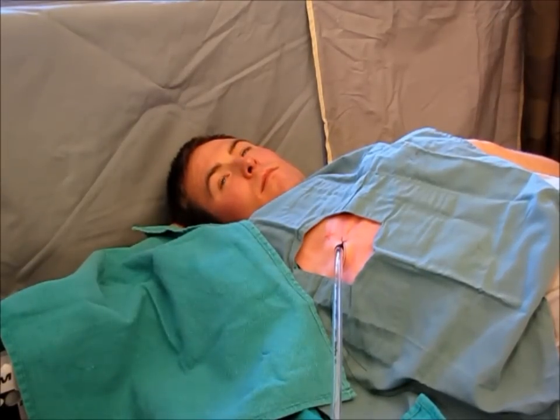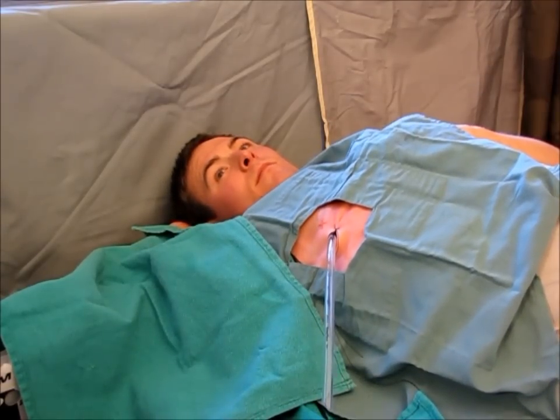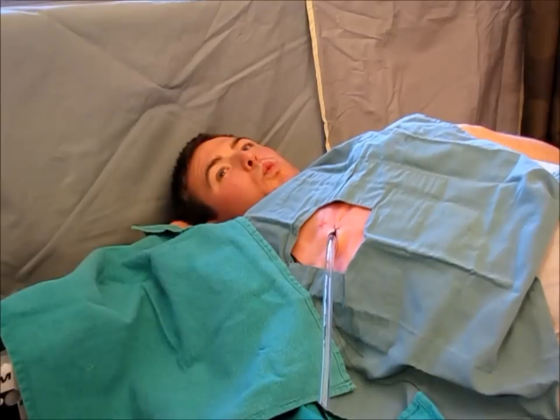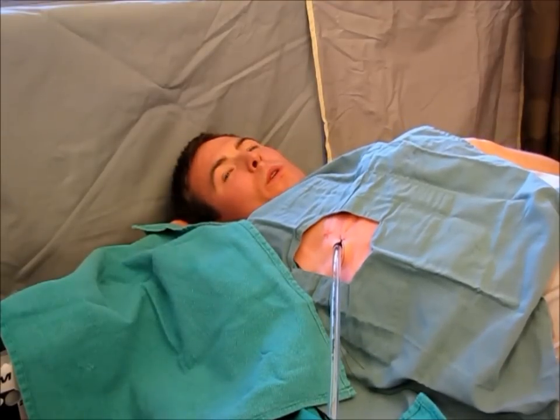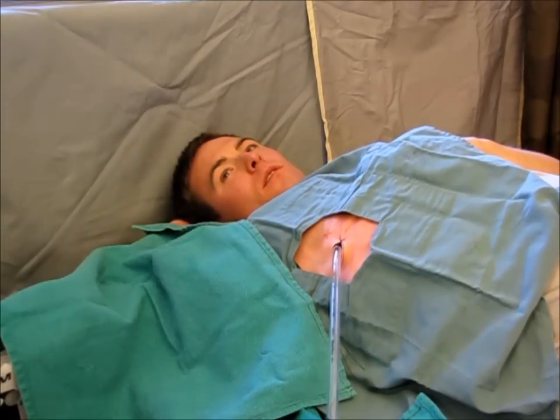Prior to pulling the chest tube out, have the patient take a deep breath in and blow out through the mouth with pursed lips. Practice with the patient by counting to 1, 2, 3 — take a large breath in and blow out through pursed lips.